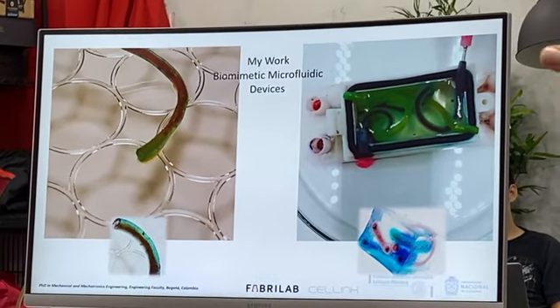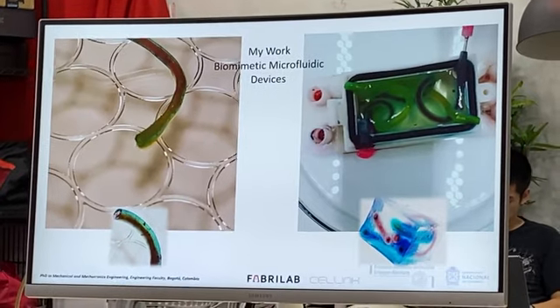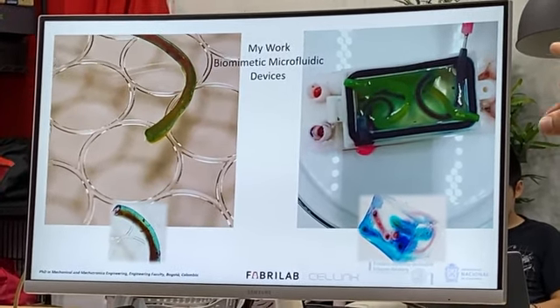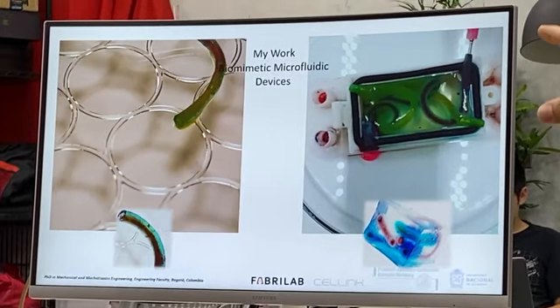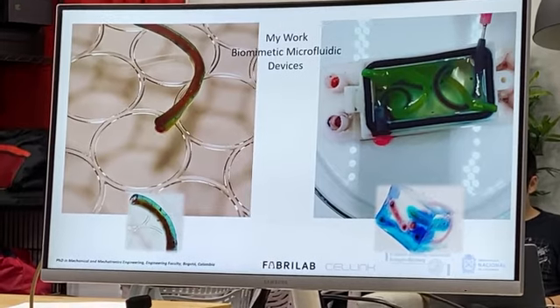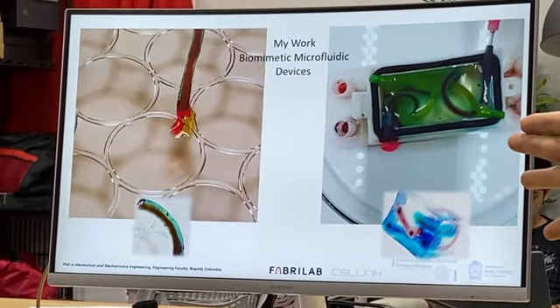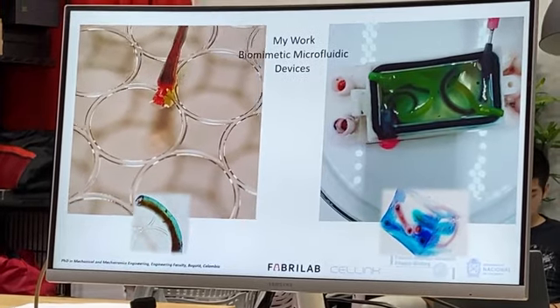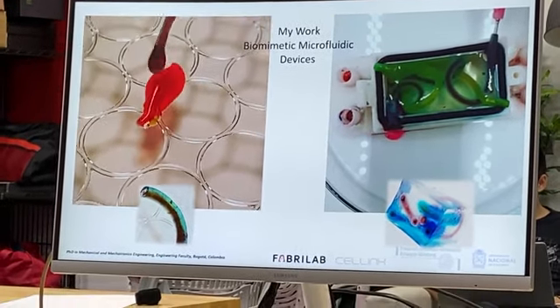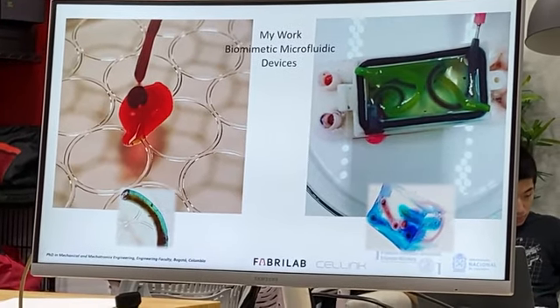So that structure has fibroblasts, endothelial cells, and an internal lumen that was made with Pluronic. So I decrease the temperature and then I perfuse a media through the vascular network, the vascular structure, just to show that its structure can conduct media and blood as well.